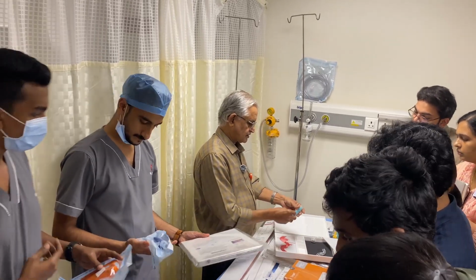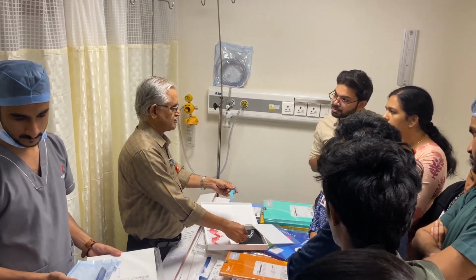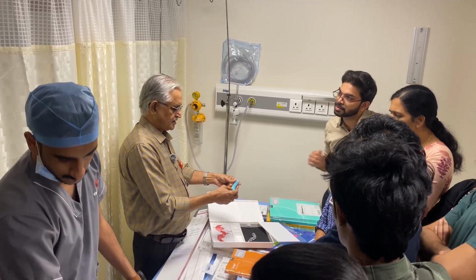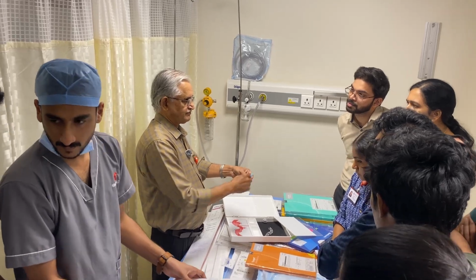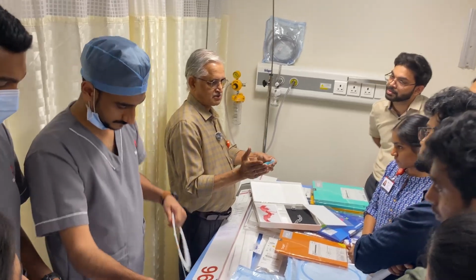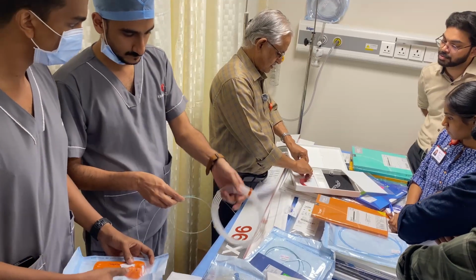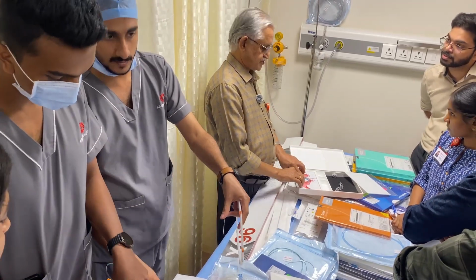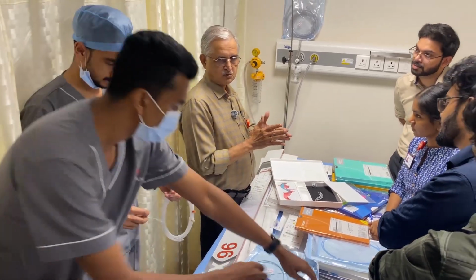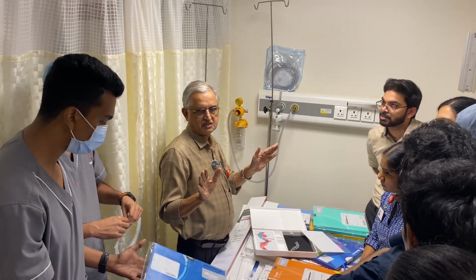Suppose it's a wide neck aneurysm and you cannot do coiling, then the other option is putting in the flow diverter. A flow diverter is basically a stent only, softer, but with very tightly arranged struts, and there can be some ribs inside which will modify the flow, so it will not go into the aneurysm. It will selectively go forward only. When you do the angiogram post deployment, the aneurysm will still fill. It will take a little time for the aneurysm to close. Whereas in coiling, once you pack it with coil, the aneurysm should not be seen at all.